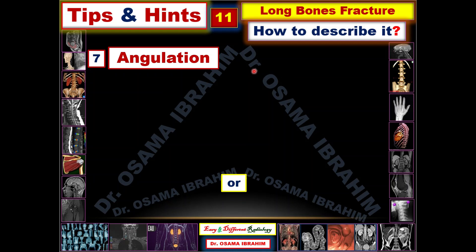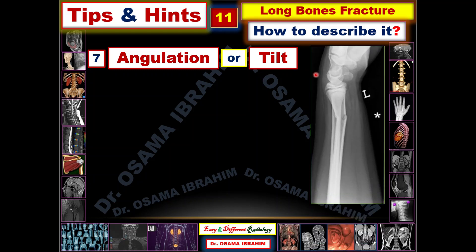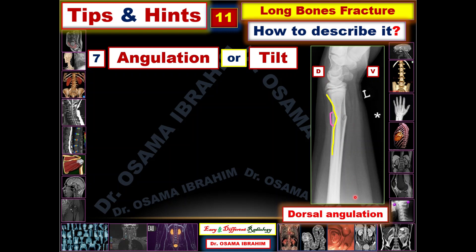Number seven is angulation, which can also be described as tilt — they have the same meaning. For example, this radius shows a fracture at the distal third, and the fracture is angulated, meaning it forms an angle. This is the dorsal aspect, and this is the volar aspect of the wrist — the scaphoid bone points to the volar aspect. The angle formed here is at the dorsal direction, so there is dorsal angulation, which can also be described as dorsal tilt.